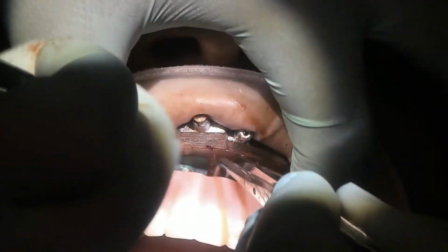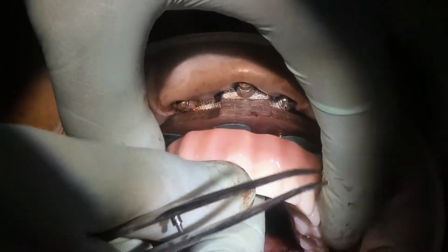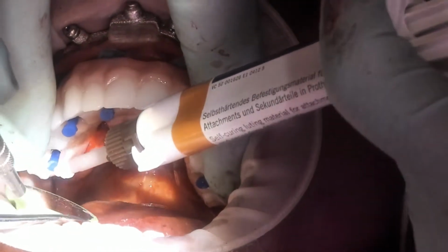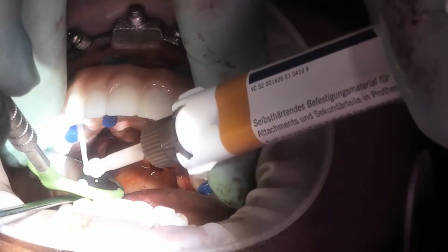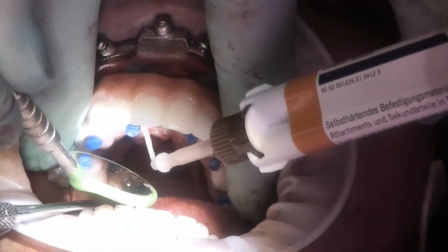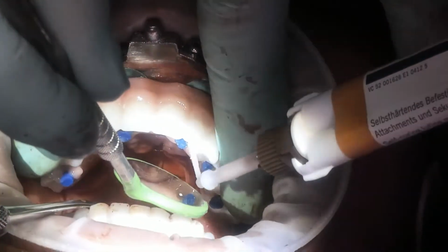Once the prosthetic is fully seated onto the carrier guide and there's no rock or gap, adjust as needed. Then the small blue blockout plugs are placed in each cylinder, and then the Voco or other material is used to pick up the prosthetic. We really only recommend Voco or perhaps Stellar. The Voco that we send is a self-cure. It is not a light or dual cure. It takes about 120 seconds.